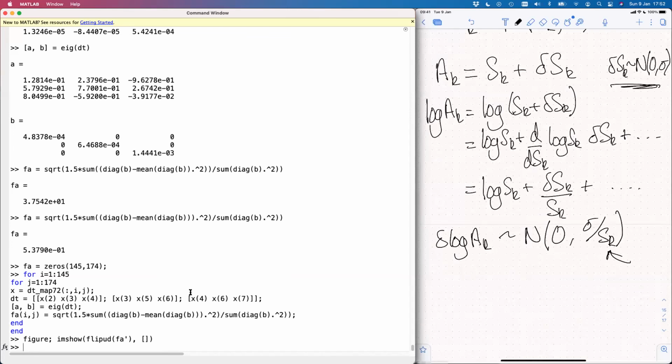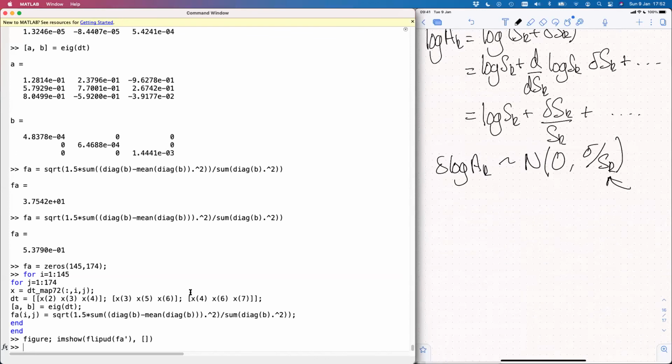So you'll recall from the previous lecture that the difference between standard least squares, where we compute the pseudo inverse (G transpose G) inverse times G transpose as our mapping from the measurements to the unknown parameters, so that's standard least squares.